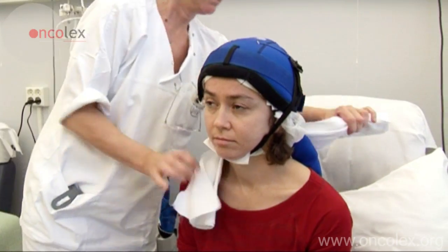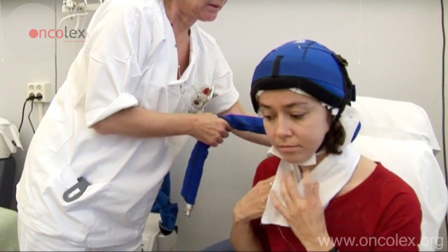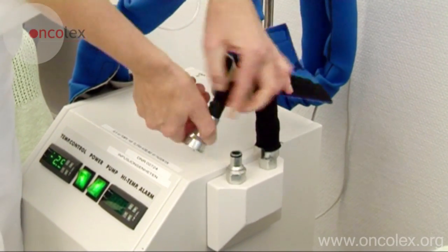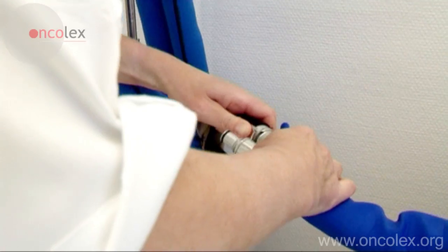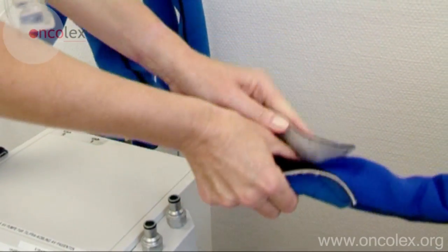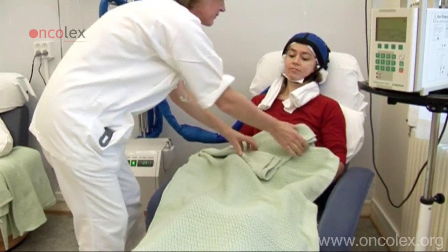Place a towel under the tube in the patient's neck to protect it from the cold. The patient is now ready for treatment. Turn the pump off on the machine and connect the cooling cap. Turn the pump on again. Cover the patient with a blanket for warmth.